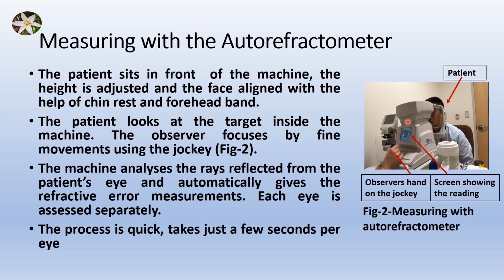The measurements can be seen on the screen and a printout can be taken, which is used for prescription of glasses. The process is quick, takes just a few seconds per eye.